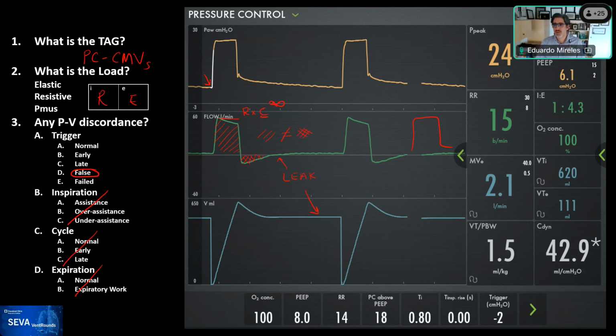So essentially we're pressurizing a system, but you cannot necessarily see the tidal volume. This reminds me a lot of when you're ventilating somebody with high frequency oscillation, in which you can have a massive leak and you're pressurizing, but you cannot read the tidal volumes, and so you're going by chest distension and by gases and saturation, right?